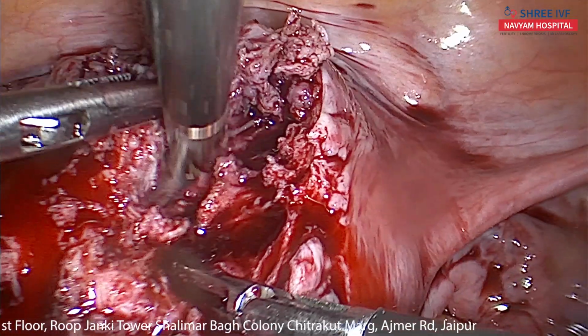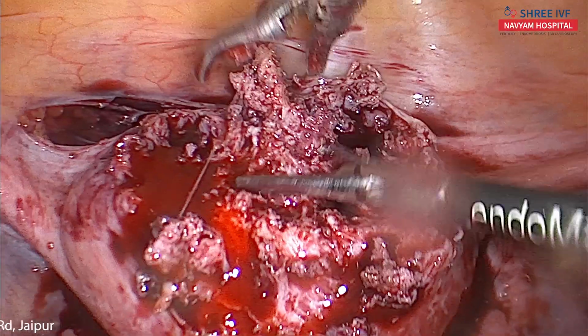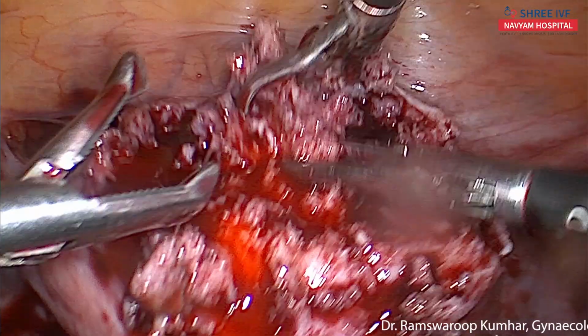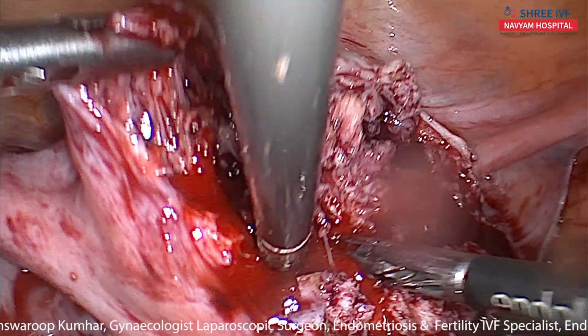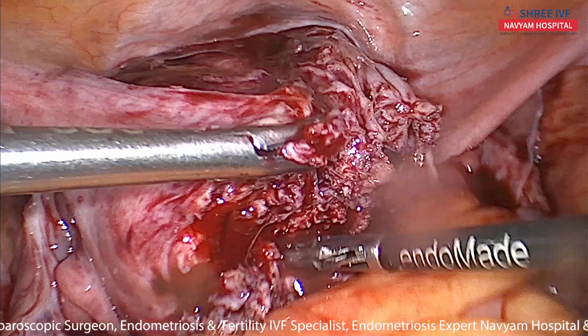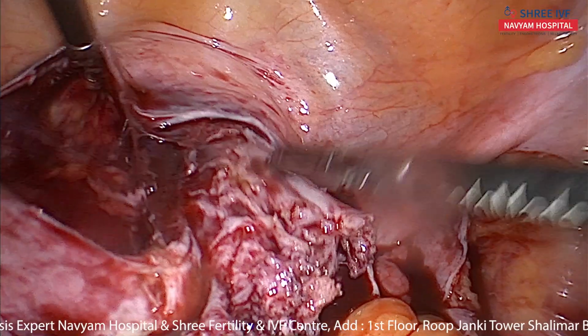If there is any myoma, no. Palpate, no. No myoma on this side, no. Furthermore, deep down here, no.